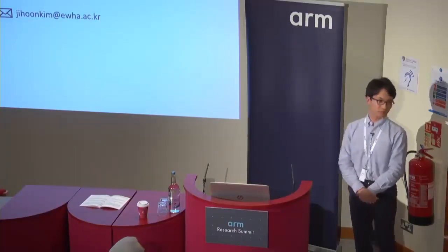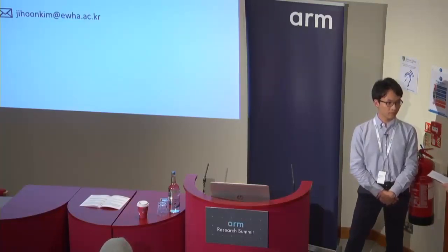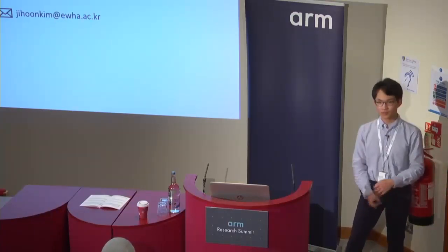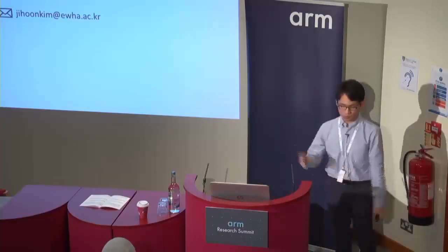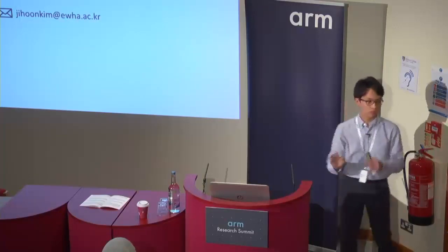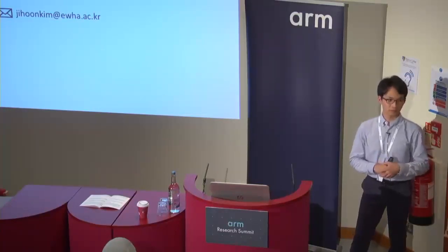I have a question. Yes. So it looks like your device has 8 electrodes, which seems like less than one of those caps. So the effort for the user, is it more difficult to make things happen, or is it comparable effort, mental effort? The number of electrodes is increased from 1 to 8 channels, but these 8 channels are located on the occipital lobe. So it may be comfortable to users. Yes. Okay.